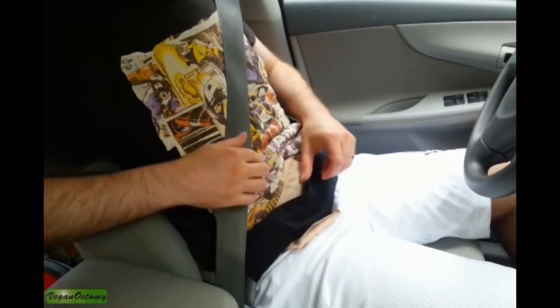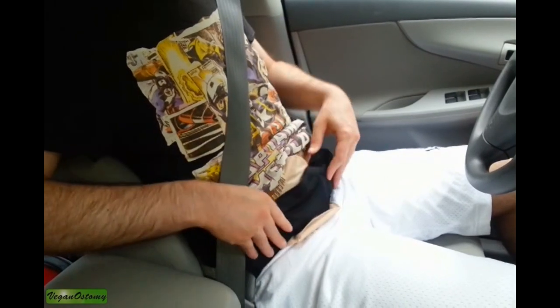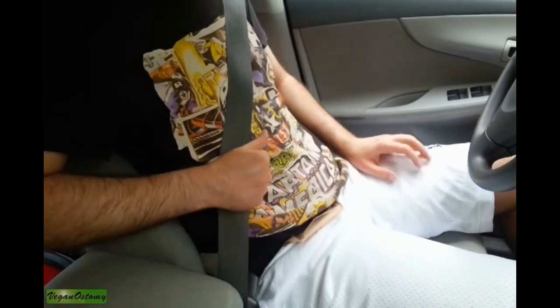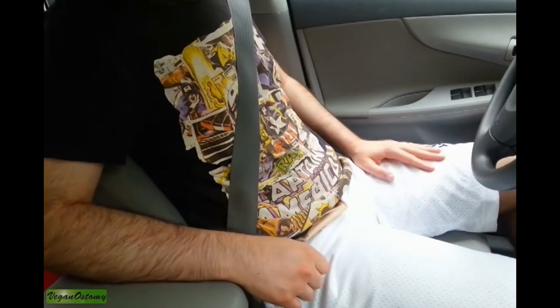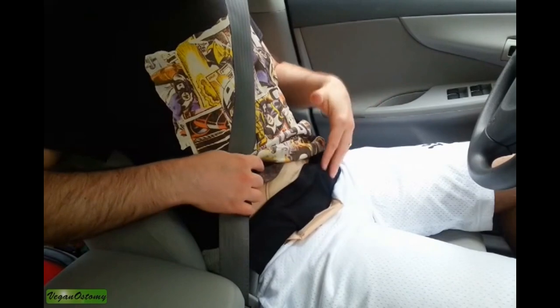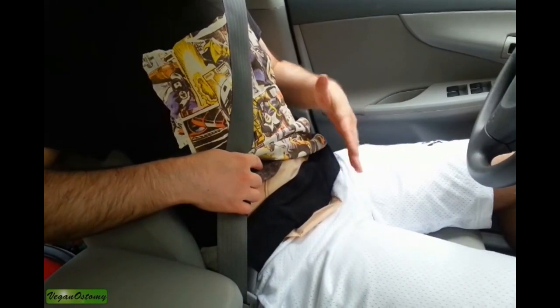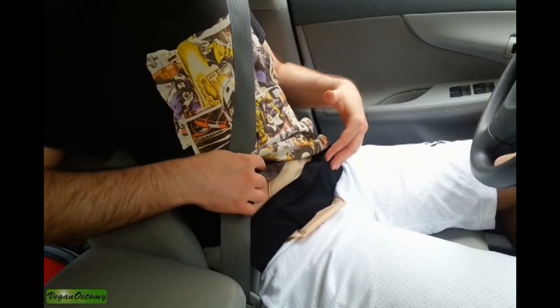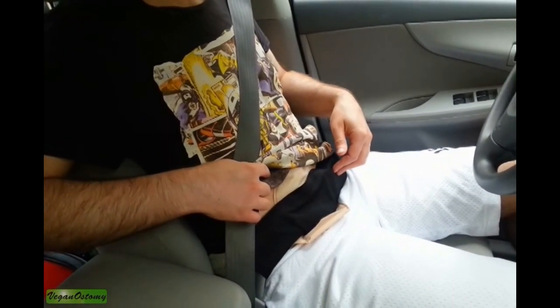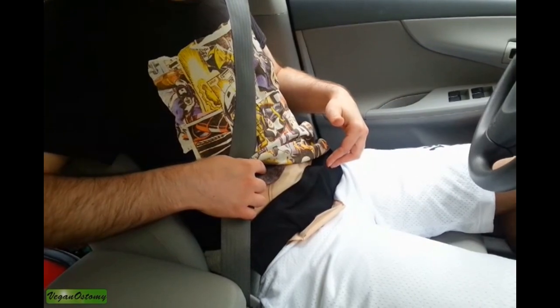You can see there's a bit of a gap that protects the stoma from any impacts. I've been using this product for several weeks now — I absolutely love it. I would recommend this to anyone; it just works, it's so simple, and it makes driving a lot more comfortable. If you want to check out the full review, please visit veganostomy.ca and leave any comments. Thank you.